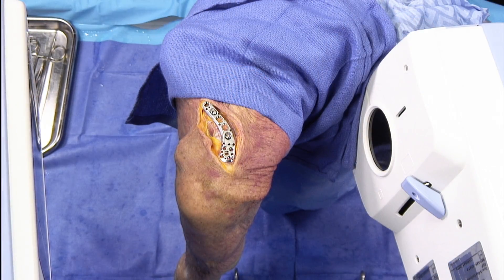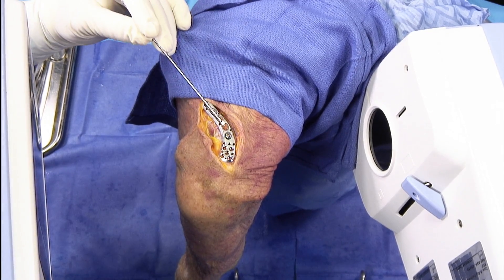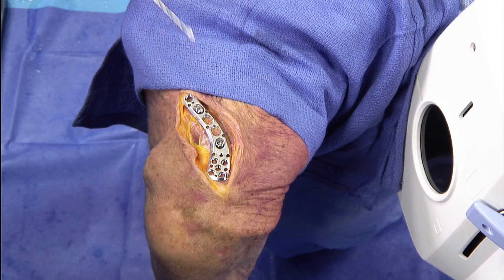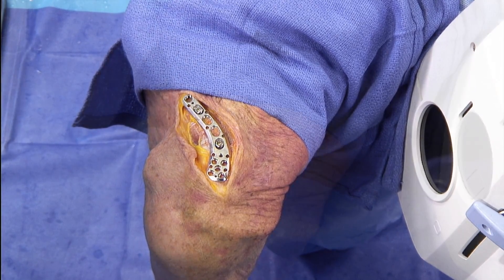We'll line up the fluoro to get a good shot of the clavicle and the coracoid relationship, which is usually distorted a bit from the fracture. Then we'll line up where our drill pin is going to go when it comes through the drill hole. We've lined up the plate so that our drill hole is directly over the coracoid, and we're going to put it in one of the oblong holes right there.